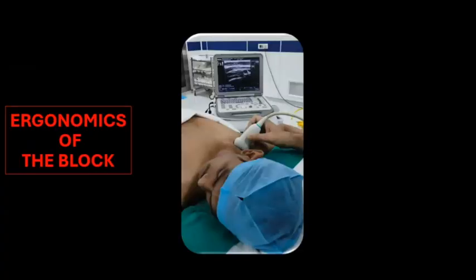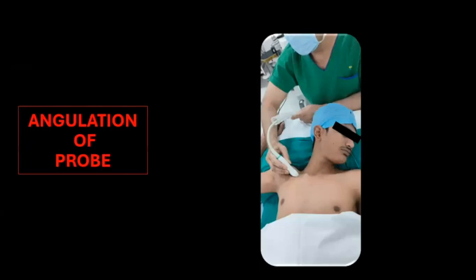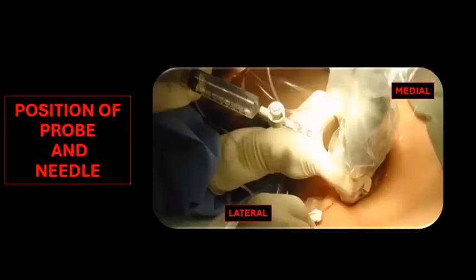If you are at the head end of the patient, then the ergonomics should be that the ultrasound machine is on the ipsilateral side towards the axilla. But if you are operating from the distal end, then the machine should be at the head end of the patient. There has to be cephalad angulation of the probe below the clavicle so as to visualize the plexus clearly. Usually the direction of the needle is from lateral to medial.